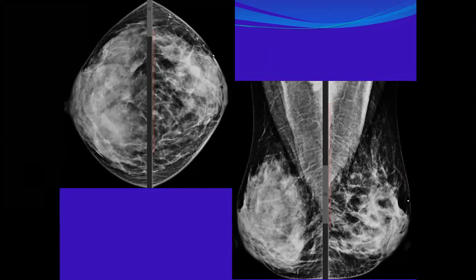So it will be alarming or worrying if it is associated with symptoms, especially if there is a palpable abnormality. Yes. If a palpable abnormality, it will be worrying. I have to go further.